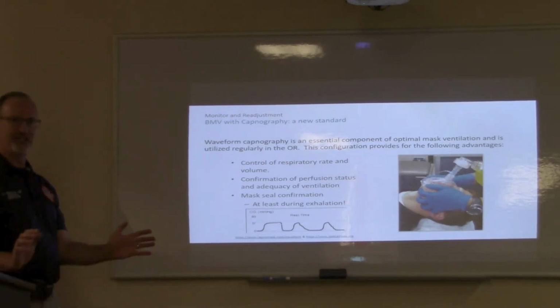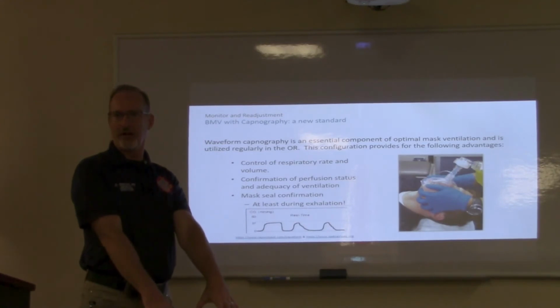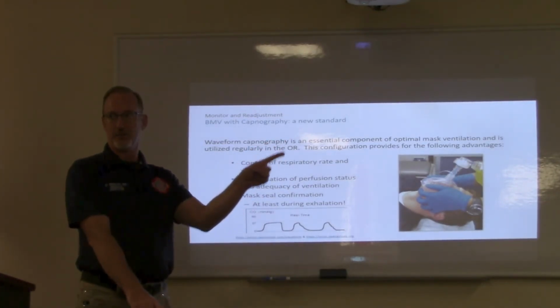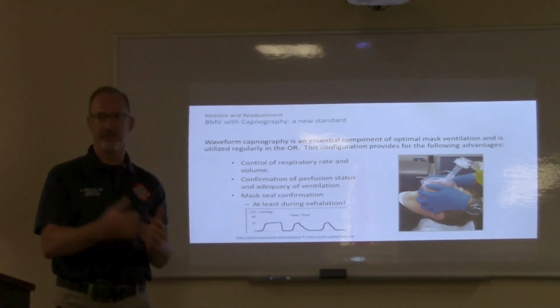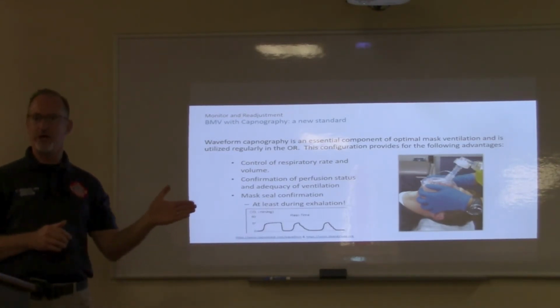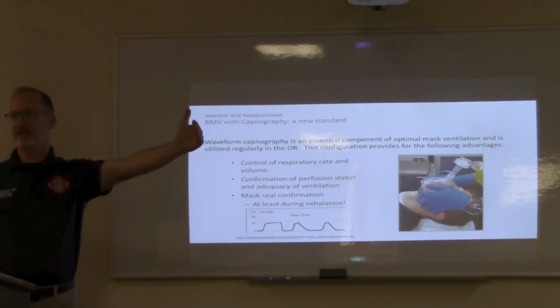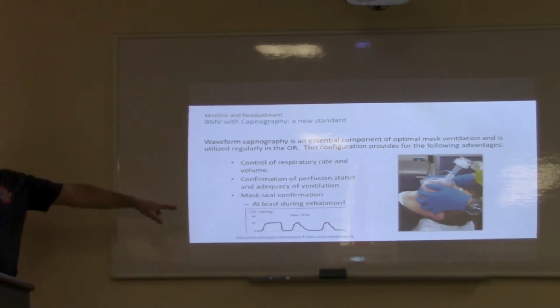So you often see patients lying here, somebody here doing really important work, but the monitor is facing that way. So if you're the person who's bagging, or doing the seal and the ventilations, it's totally reasonable to ask, hey, can you turn that monitor a little bit so I can see the CO2? I mean, that's taking it to another level if the person at the head, BLS, ILS, ALS, is focusing on that as well. Okay.